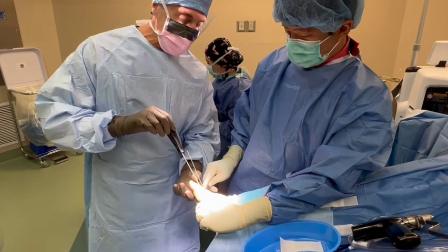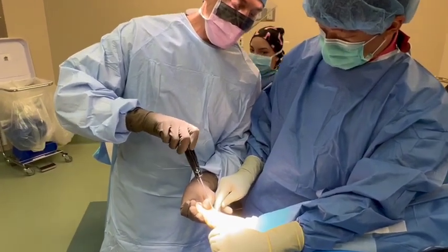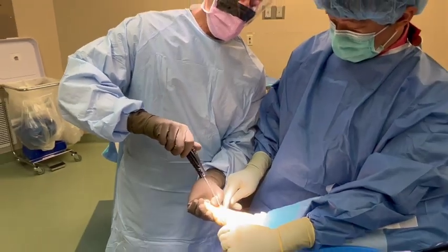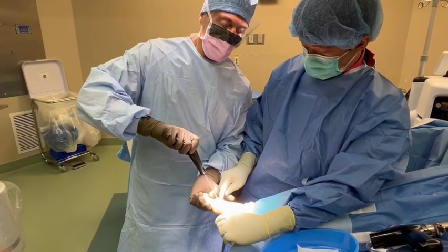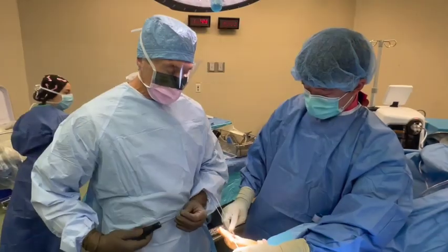This kit has a tap, and I think that's very necessary, because even though it's a great product — and some of the metal screws don't require this — you want to make sure that these threads catch, since they are a natural bone, and they won't strip. Okay, now we're going to put the implant in.